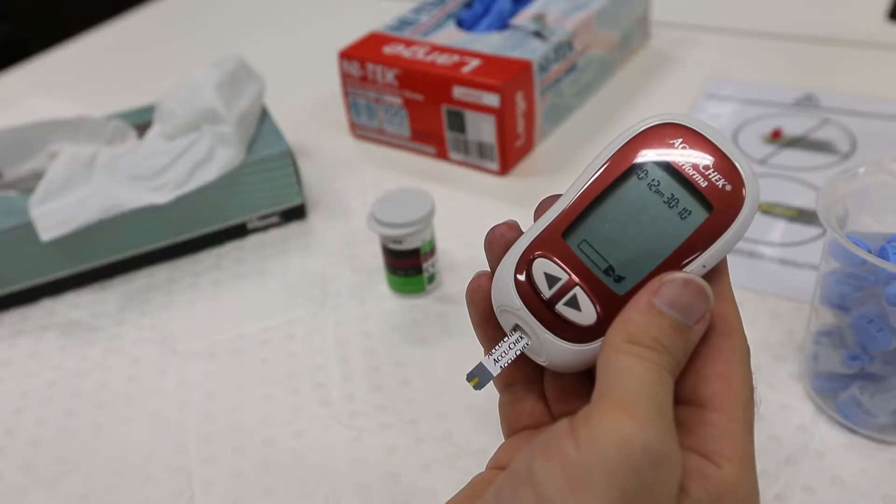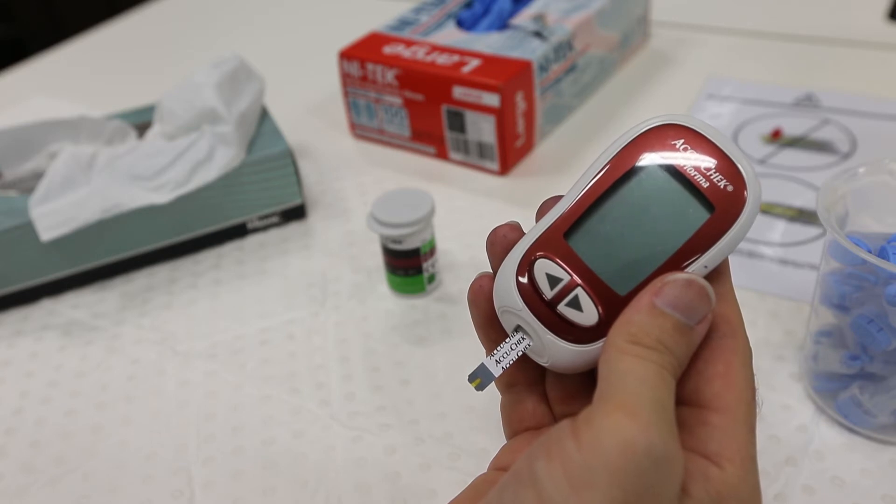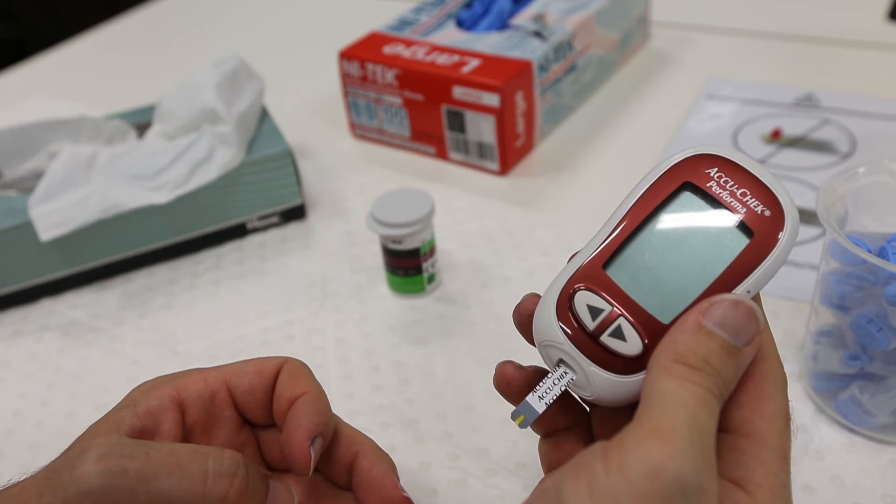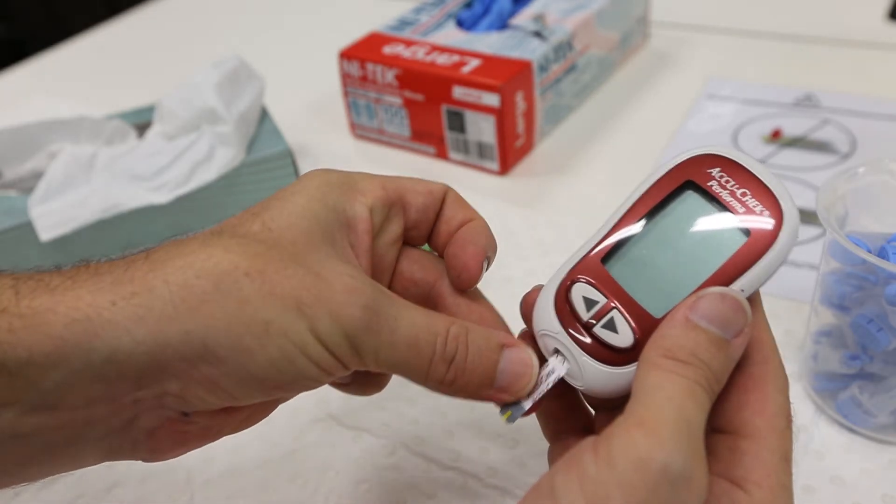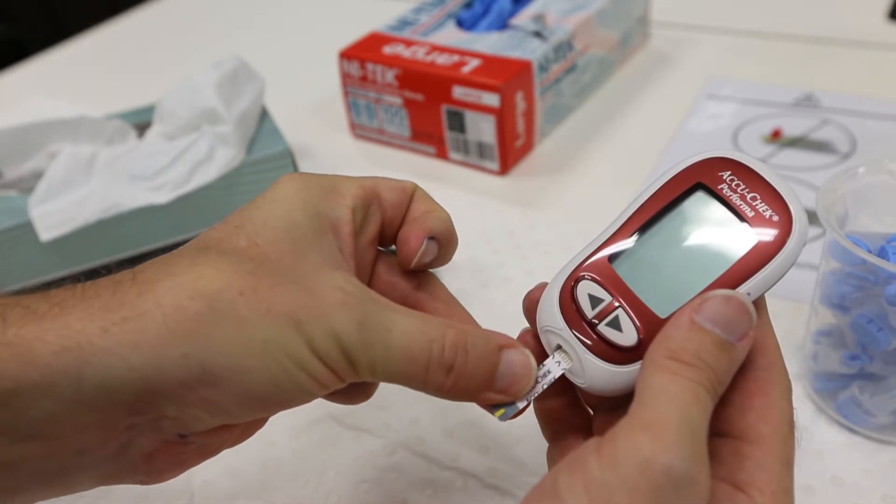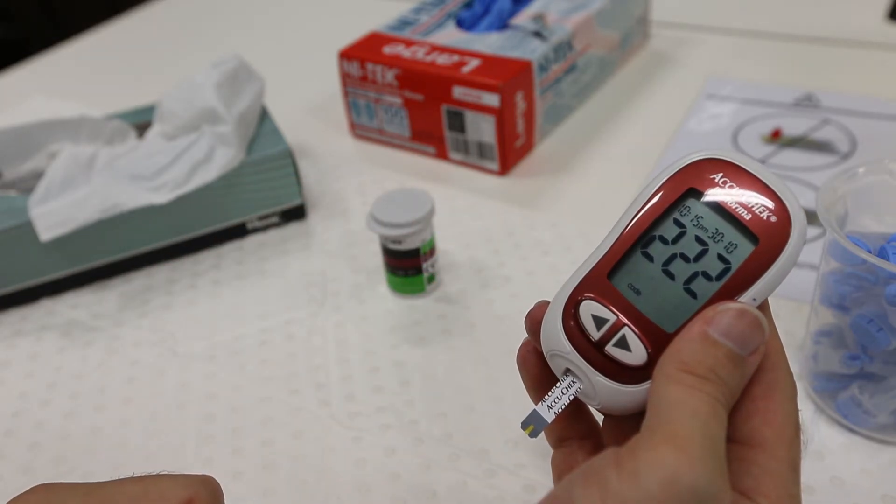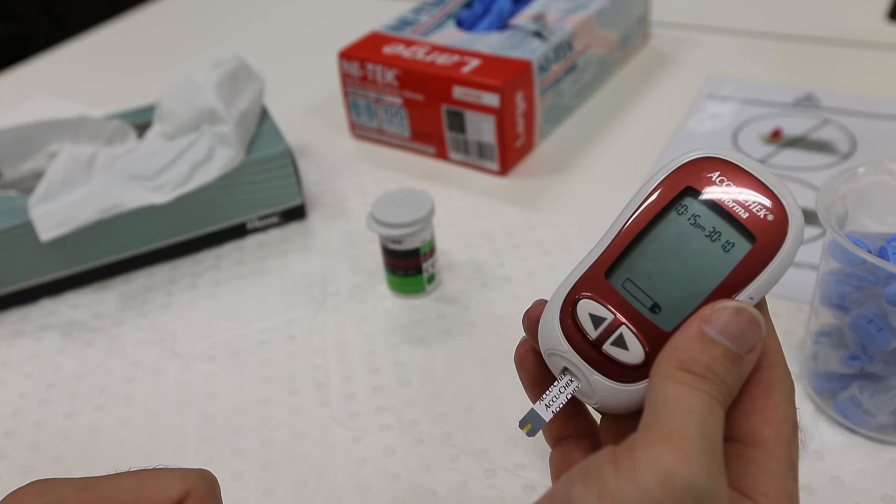After inserting the test strip, the blood glucose meter will switch off in about 30 seconds. If this happens and you have not yet sampled your blood, simply remove the test strip and then reinsert it into the unit. The blood glucose meter will then switch back on, display the code before displaying the ready symbol.